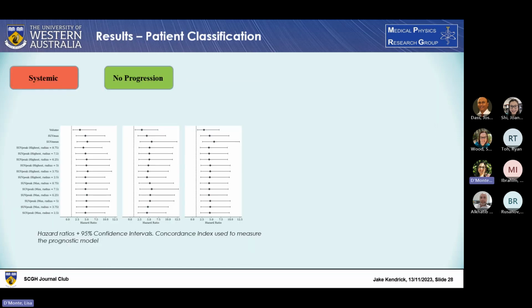So we can look at some of the results. We followed the patients up again from the time of their follow-up scan to facilitate the survival analysis.